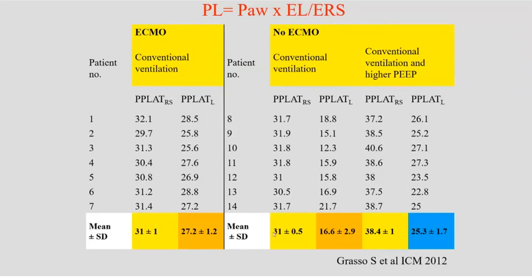And there's another group of patients, same plateau pressure, but much lower lung plateau pressure. They say for these patients, the distending pressure of the lung is not so high. We can increase PEEP even if plateau pressure goes up above 30. And they report that they did not submit this patient to ECMO. No outcome data really, but again, a physiological reasoning which makes sense.